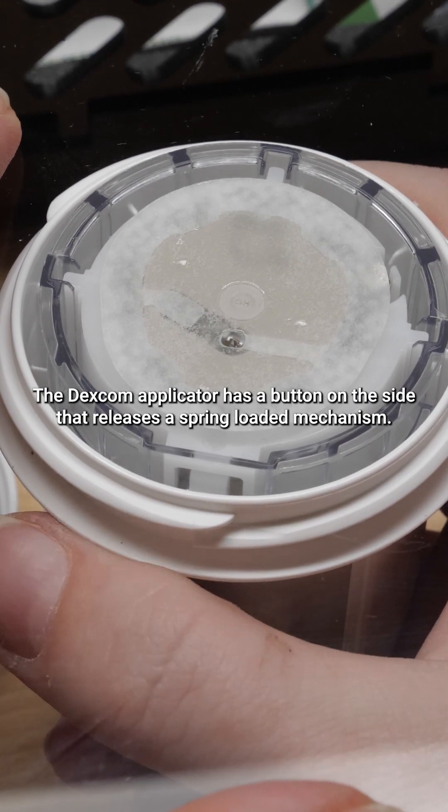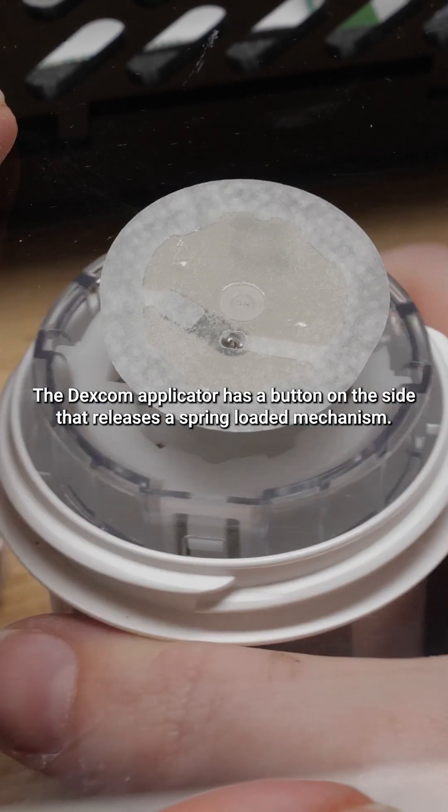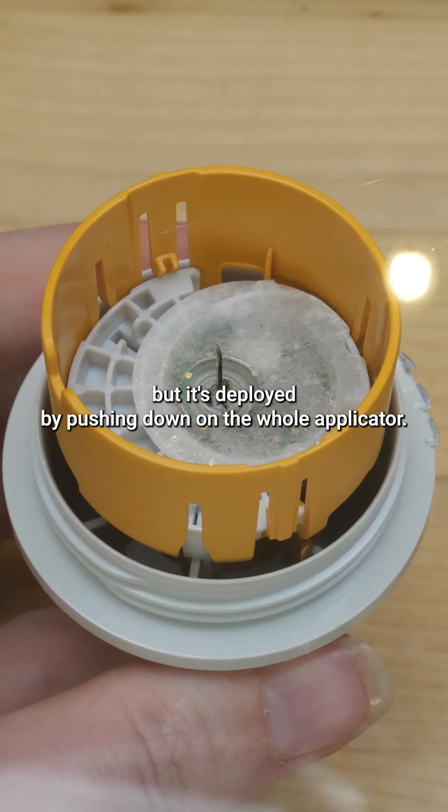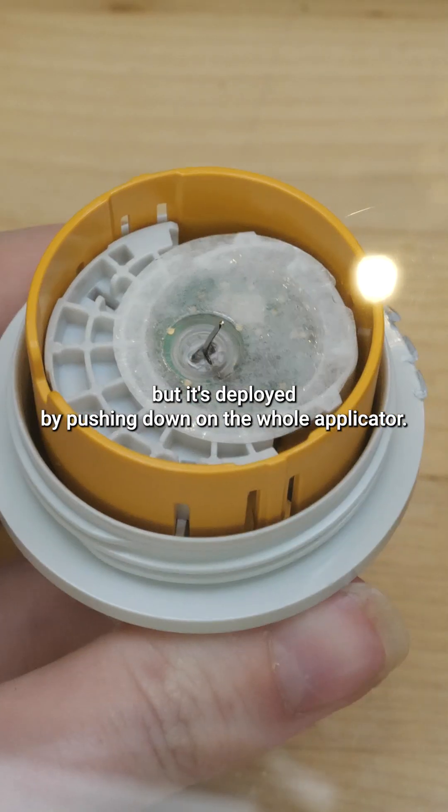The Dexcom applicator has a button on the side that releases a spring-loaded mechanism. The Freestyle Libre also has a spring-loaded mechanism, but it's deployed by pushing down on the whole applicator.